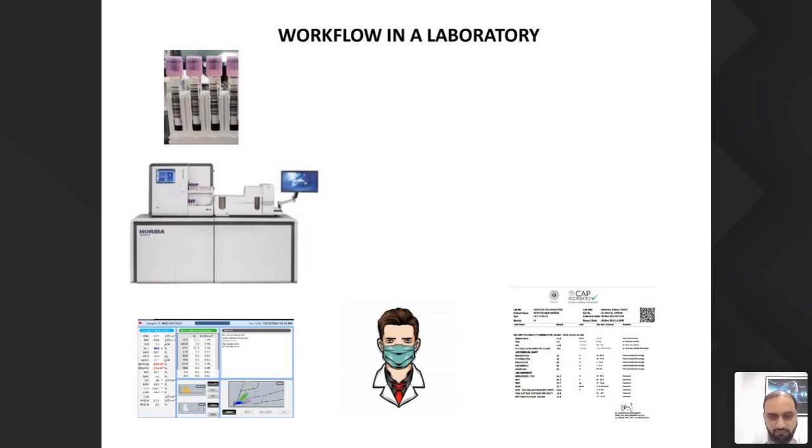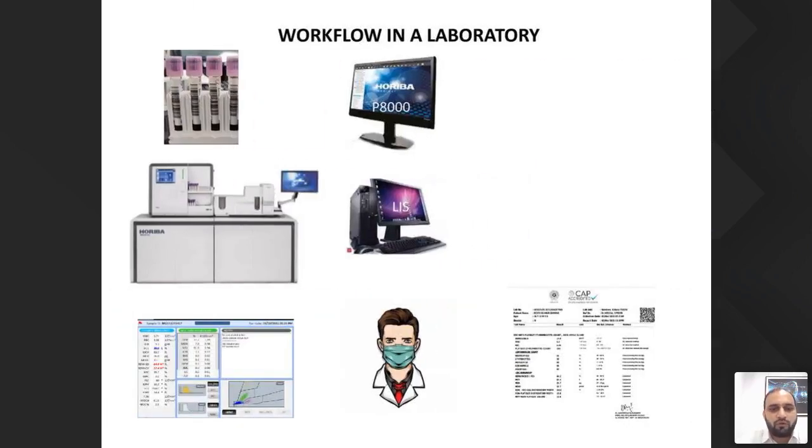One advantage that I have in my lab is with this P8000, the middleware which Horiba has provided. All the instruments have their own middleware. I find this comfortable because I can directly see it on my LIS. So I need not get up from my desk to see the histograms. I need not have any printouts going around for all these flags and values and histograms. I directly see it on my computer screen. I go through the values, the flags. If required, I would ask for a slide.